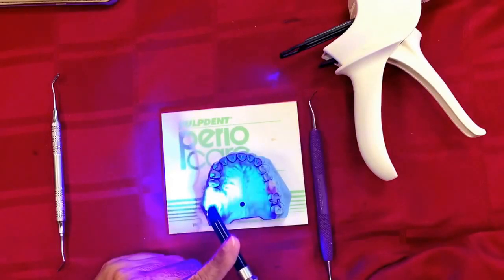There's no concern about the depth of cure — it takes full-on. For contouring, finishing, and polishing, use any system you're comfortable with in your office. Just two tips: use all the steps in a wet field, and secondly, diamond polishing paste works best.